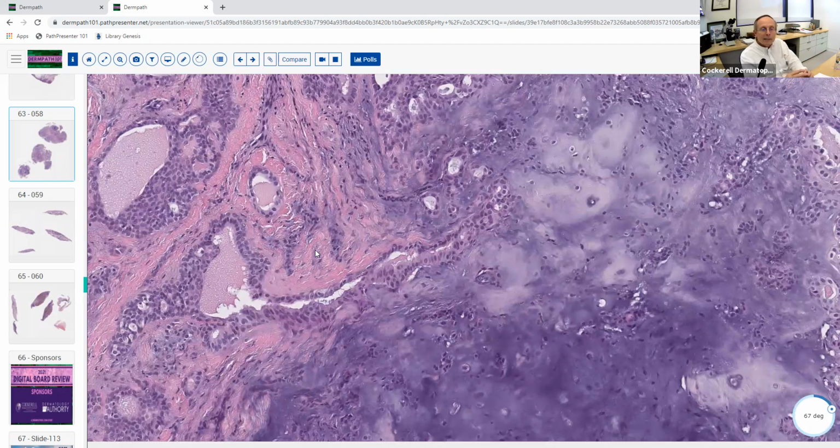It almost looks like an adenoid cystic basal cell carcinoma, but it has more atypicality and is a more aggressive lesion than a basal cell carcinoma. It's not microcystic adnexal carcinoma. You know what that looks like: small ducts that go all the way down to the base of the specimen and get into the nerves. It's not a myxoid fibrosarcoma. There's no spindle cell component, so clearly it's not that.